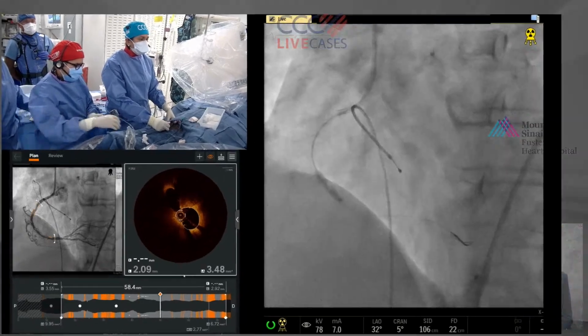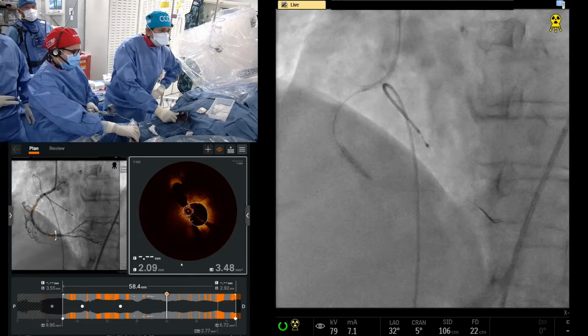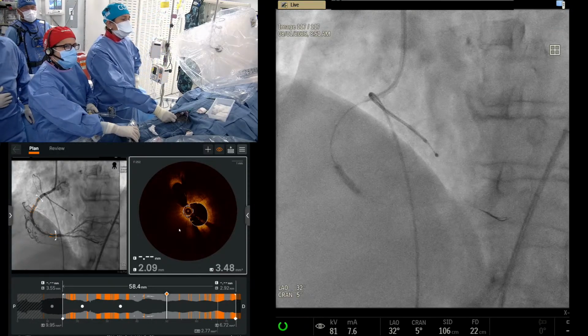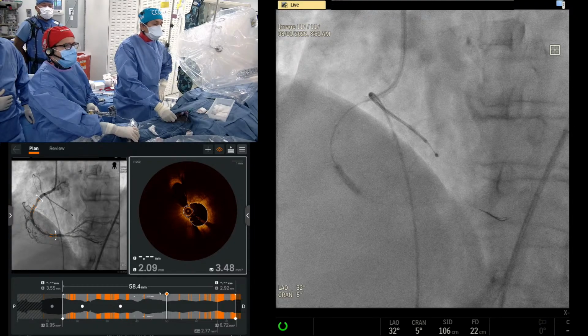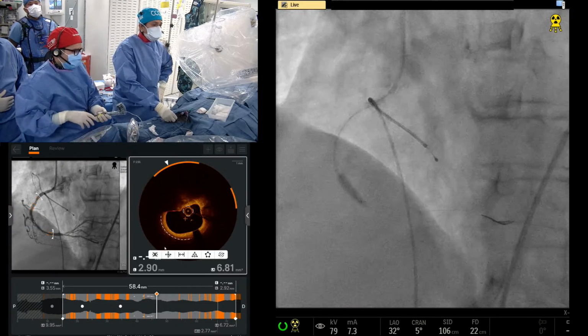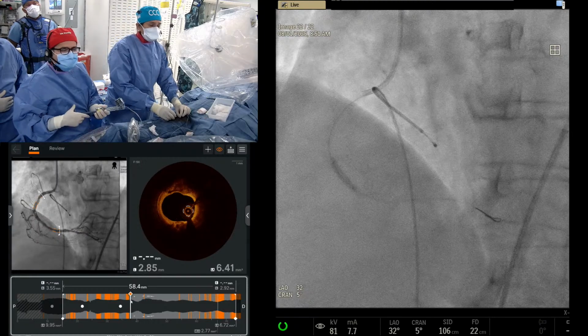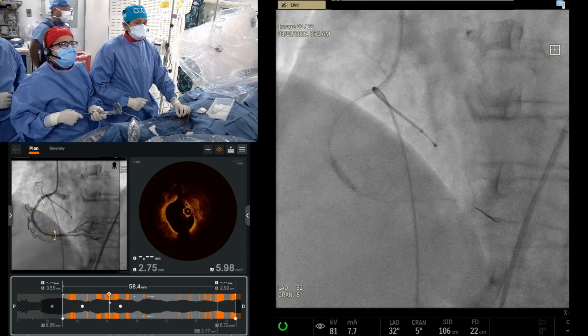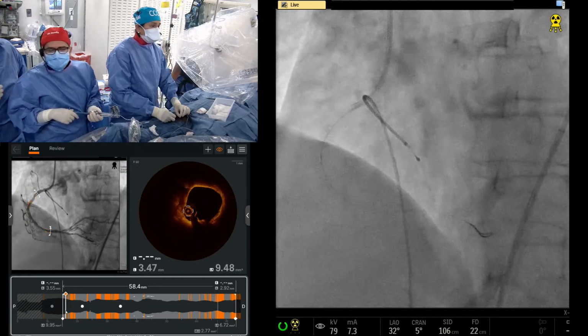I think the biggest thing about why I use imaging is if you have to do IVL, it's very important that you do 1-to-1 because it's low pressure, so you want to make sure the sound waves reach the calcium. Yeah, there is no disease. So let's go back to where the other places are. Give enough breathing time. Hemodynamic wise, we are doing okay.